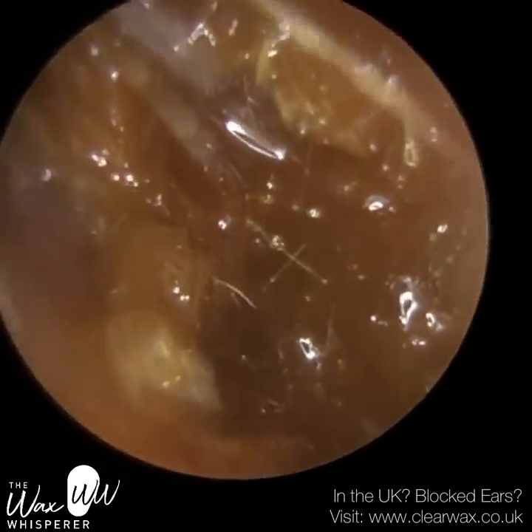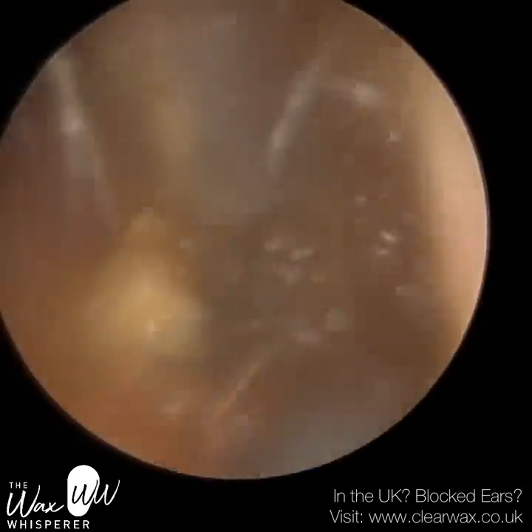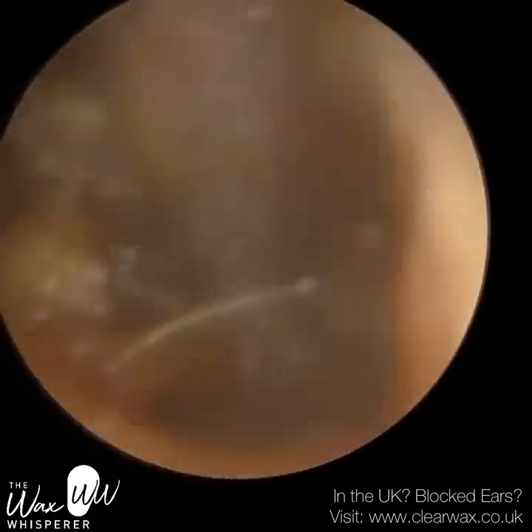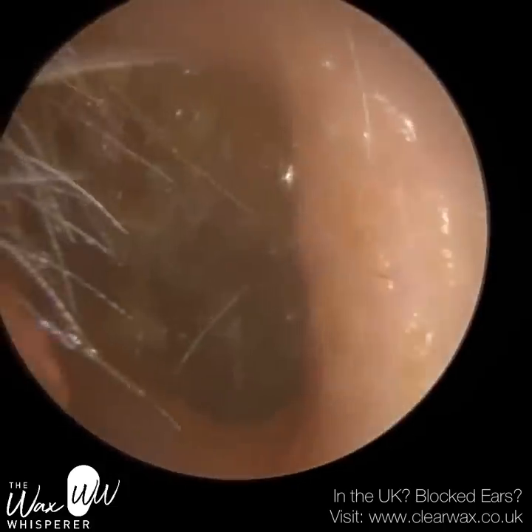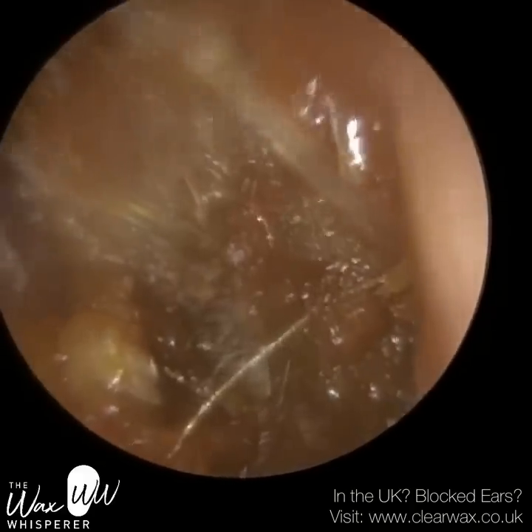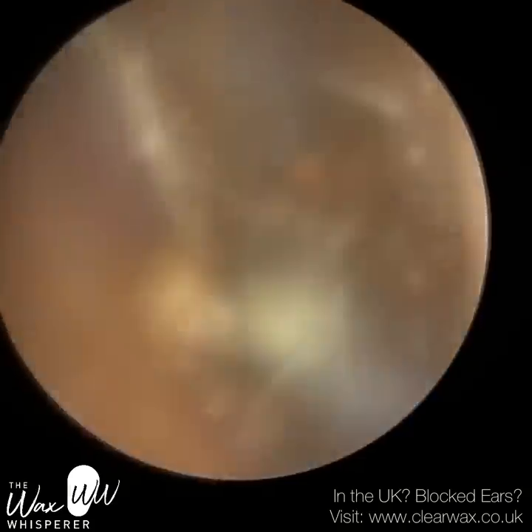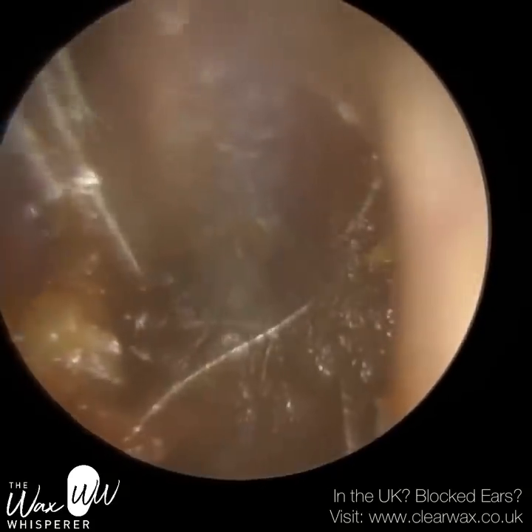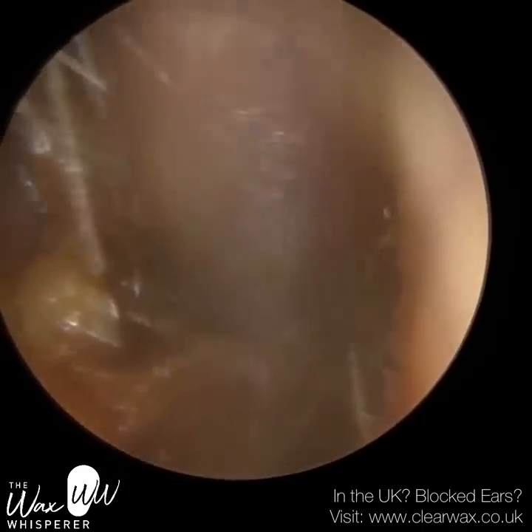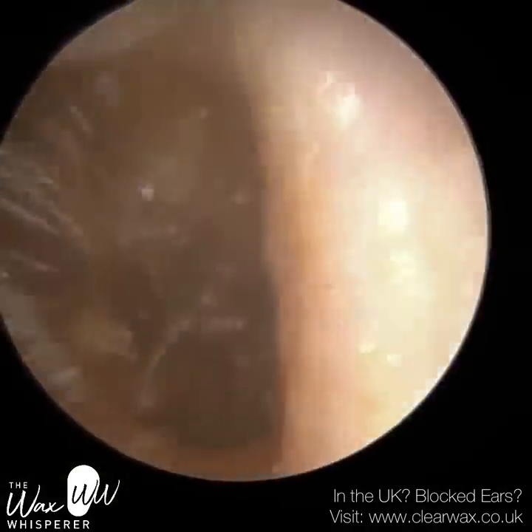So I'm just going to stretch the ear open and slowly work away at this wax. At times it might be slightly blurry because I'm actually performing microsuction whilst the oil is in the ear. Not only is the suction probe vacuuming the wax, it's also suctioning some of the oil, which can cause a bit of blur. You can see how I'm just massaging this wax, trying to tease it off the floor of the ear canal. And slowly now it's coming away.